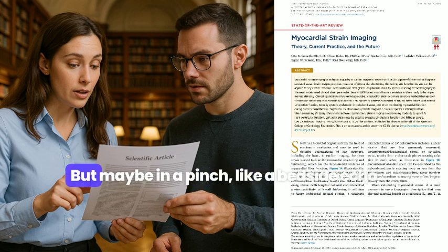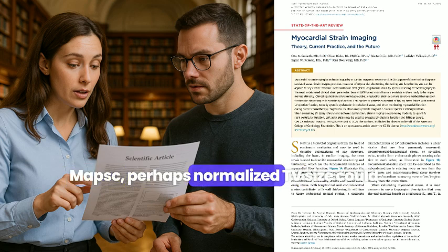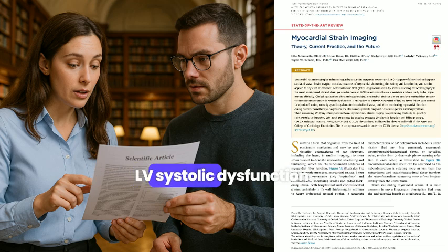Not really, but maybe in a pinch, like a bedside echo in the ICU where image quality is tough, MAPSE, perhaps normalized to LV size, could give you a quick idea if there's major LV systolic dysfunction.